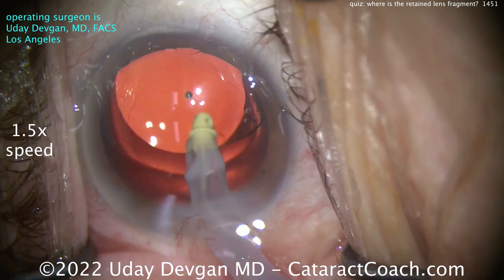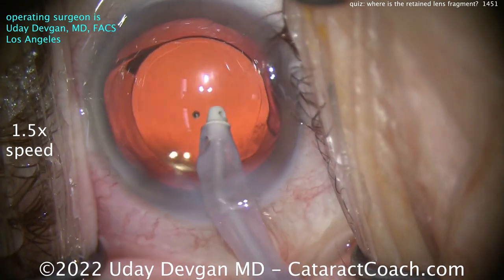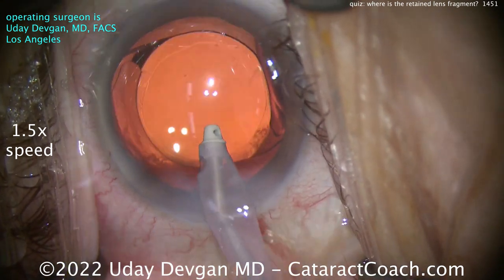We're pushing a lot of fluid through this eye — 60 cc's a minute — evacuating out all that viscoelastic and getting the lens centered. I like that overlap of the rhexis on top of the optic. I just don't see any lens pieces. We're putting a lot of fluid through the eye here.